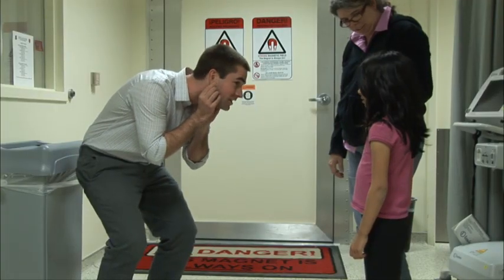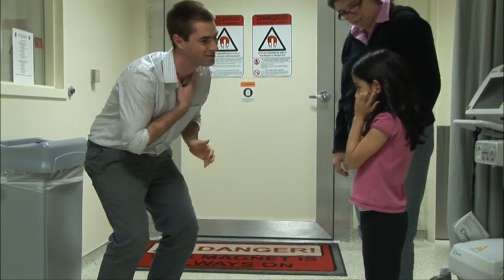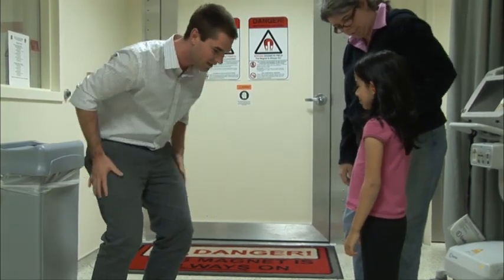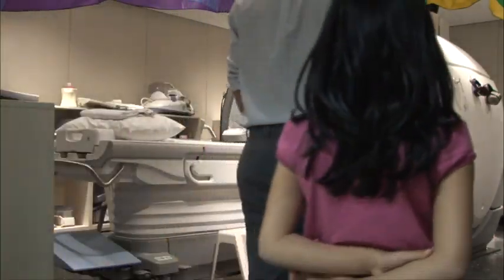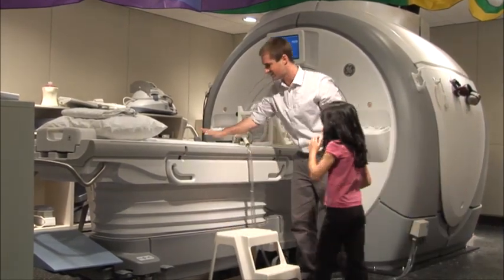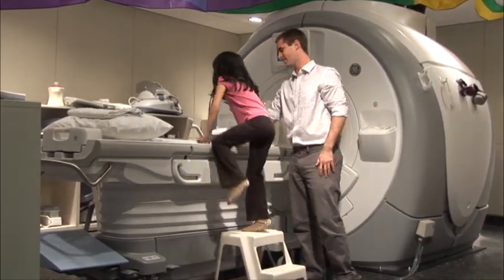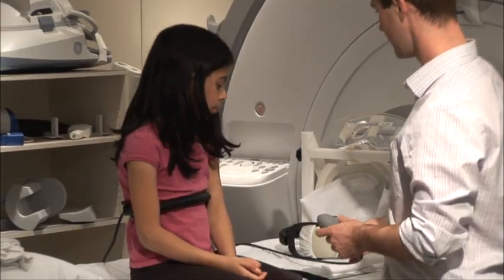Before we go into the MRI scanner room, a researcher will ask you once more to be sure that your pockets are empty and that you have no metal on you. You'll walk into the scanner room and sit on the scanner bed. You'll be holding the button box in your right hand if you're going to play any games in the scanner. In your left hand, you'll be holding a squeeze ball.